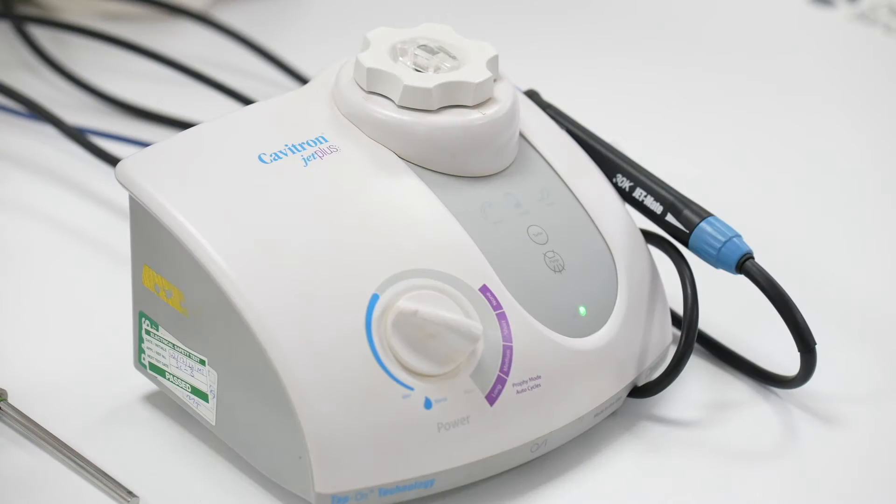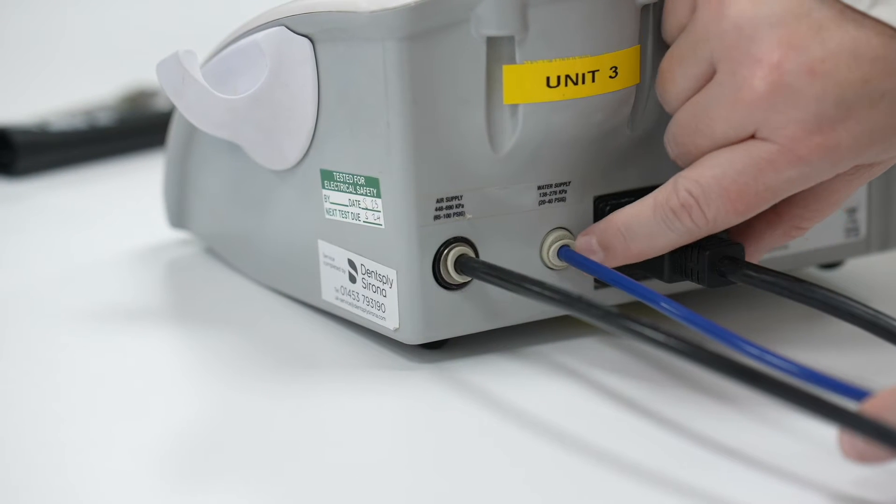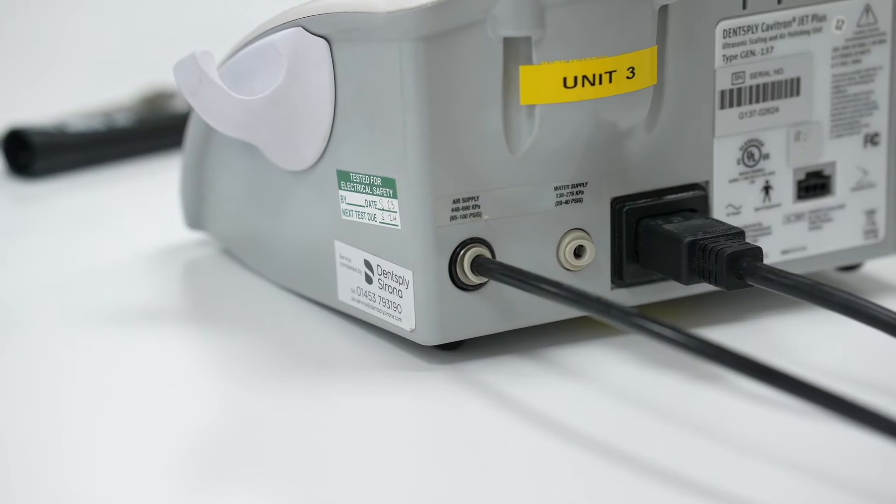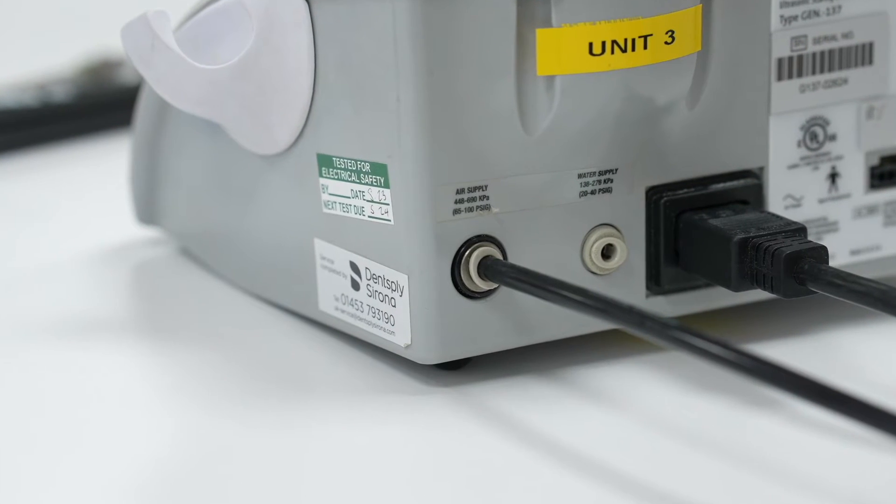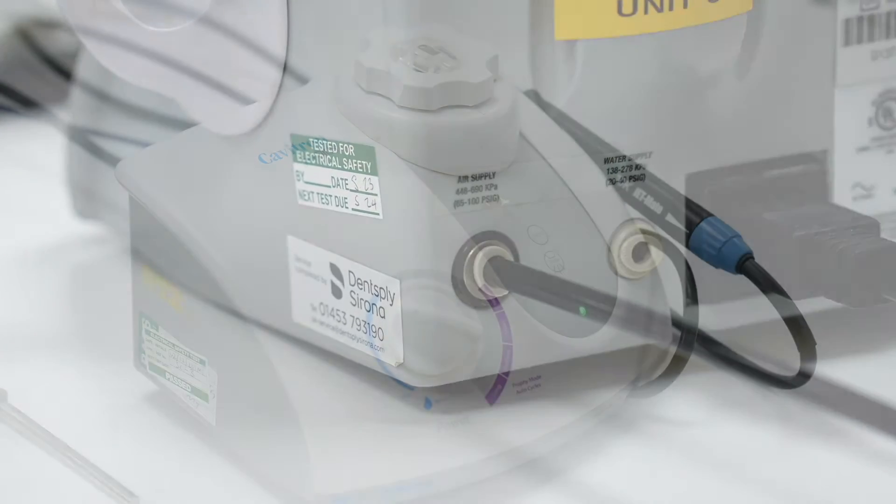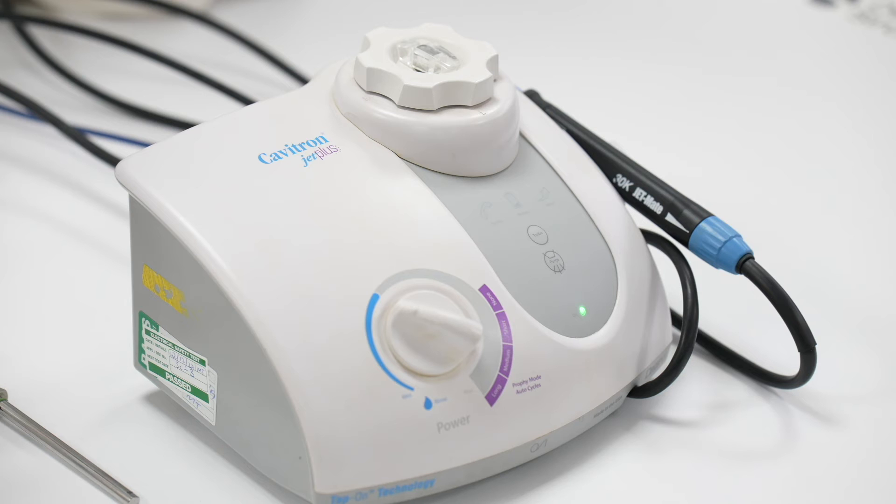On the back of the unit there is a white ring which indicates and is labelled water and a black ring indicating and labelled as air. It is simple to get it right. Simply push in the blue water line to the white ring and the black air cable into the black ring.